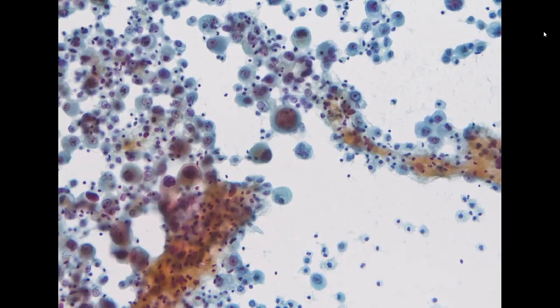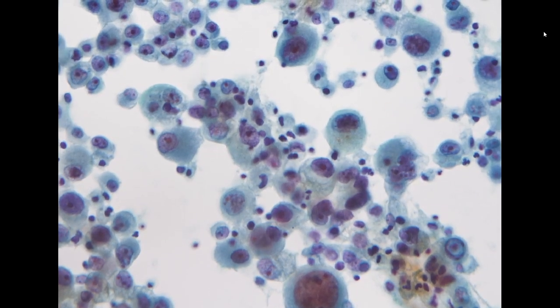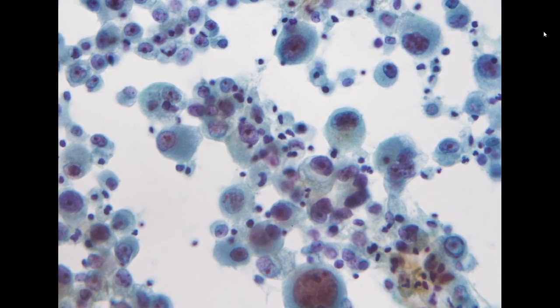So this is from a pleural effusion. The patient had lung cancer. So this is recurrent lung adenocarcinoma. So this one is easy.